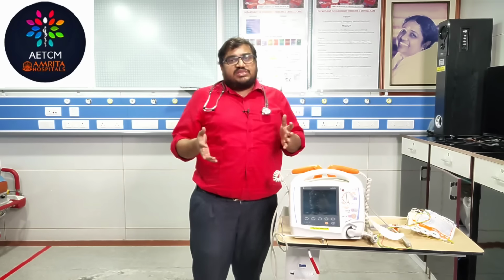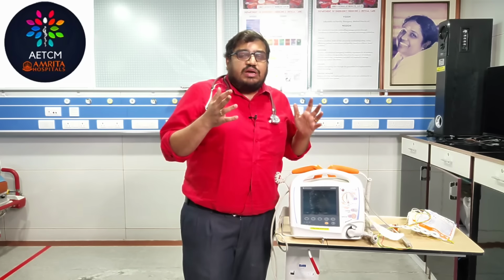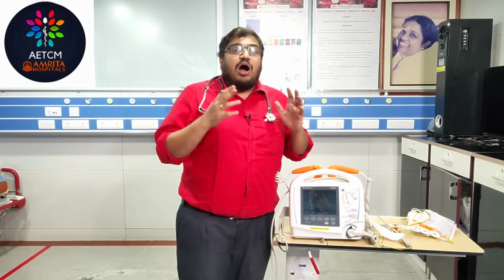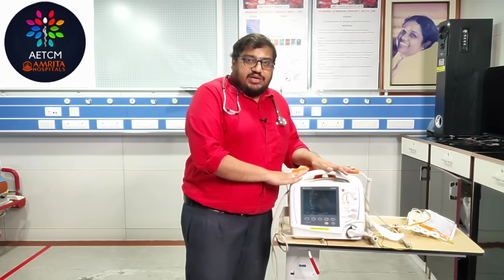So briefly, what we have discussed here are the indications for defibrillation and cardioversion, what is the difference between the two, and how to use your defibrillator. You understand?